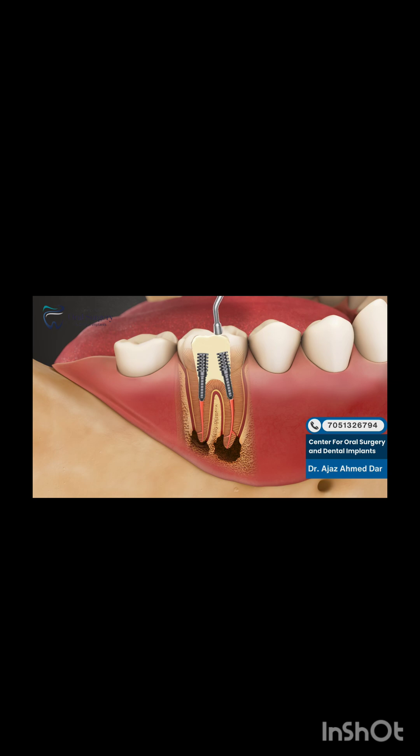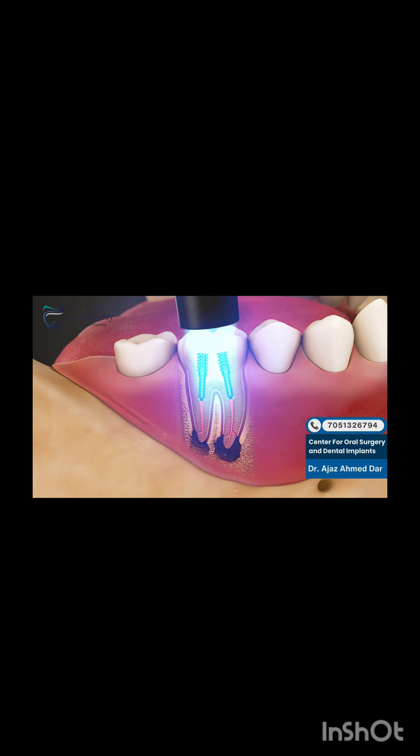The core filling is then reshaped to resemble the biting surface of the tooth and cured to hardness using a specialized blue light source.